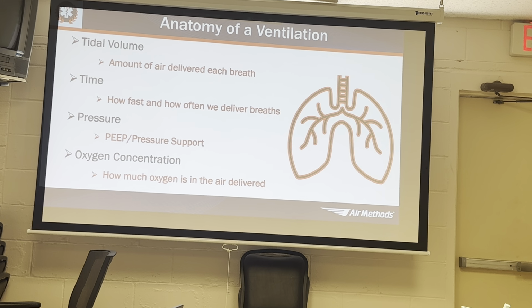Tidal volume, we talked about this, is the amount of air delivered with each breath. Our rate is how often and how fast we're delivering those breaths. The more often we're delivering those breaths, the shorter we make that I:E ratio, or the less time we have to deliver a breath and then let it exhale. So be cognizant, especially when bagging patients: we're not squeezing this thing super often, right? Every 5 to 6 seconds.